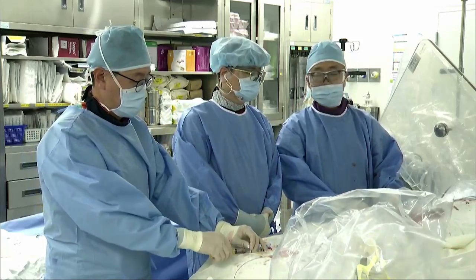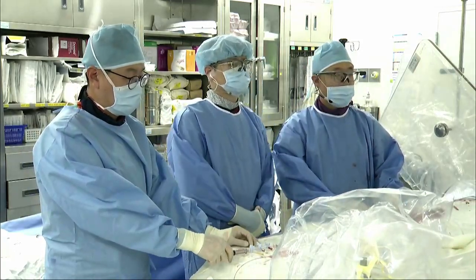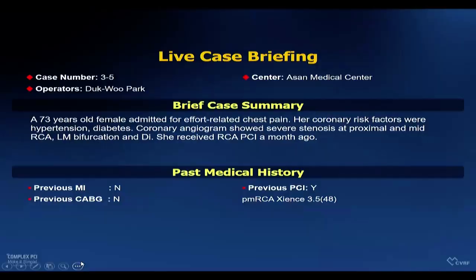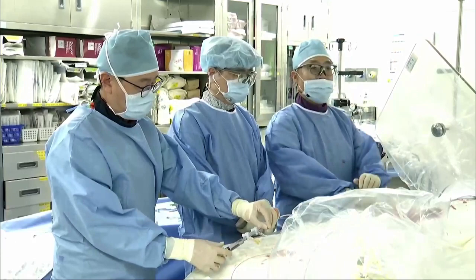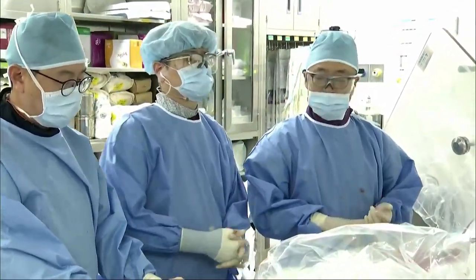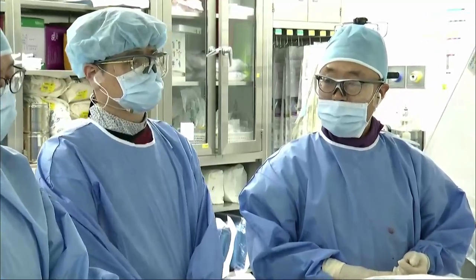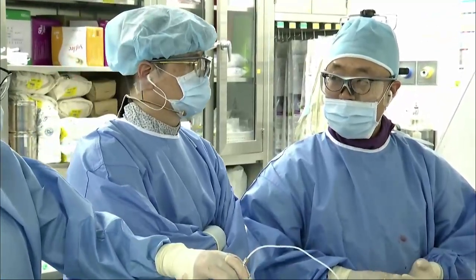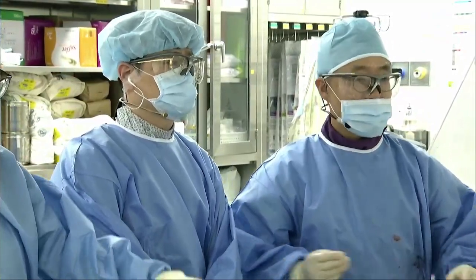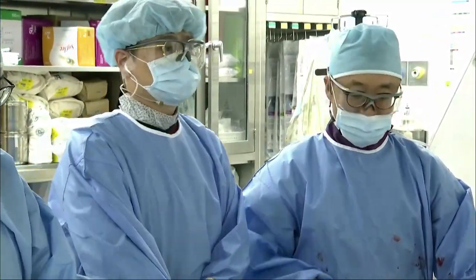This patient has a very complex lesion. Yes, very complex. Today's first live case was also a very complex case, with a syntax score of 46. This case is 49, a much more complex case. I don't believe the syntax score. Dr. Zhou, can you explain the patient?